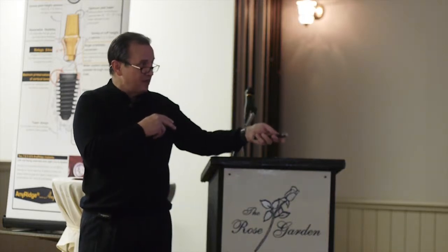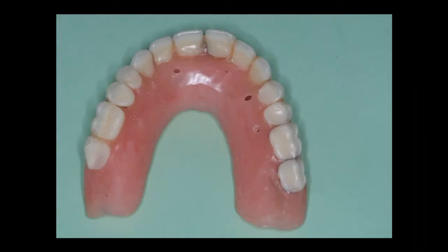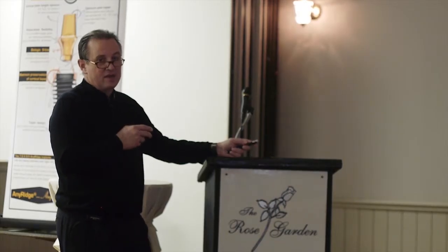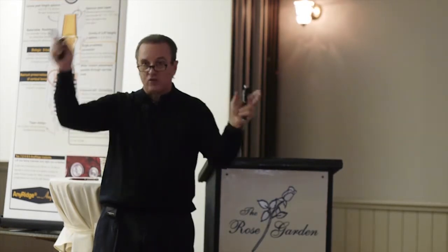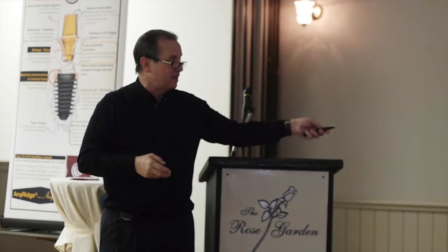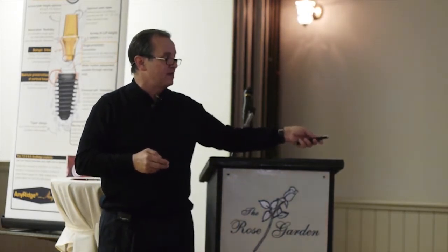Into a palateless overdenture, and if he's happy with it, then we're going to copy that and make the final prosthesis. So here, this is his original. We have used all kinds of things to block out with, but Teflon tape works better than anything, because you can just drape the tape over the locators. You don't have to punch holes or anything. You just drape it over the whole deal, and then come back and, like I said, we sandblast these housings now. And so we're going to go ahead and snap those into place.